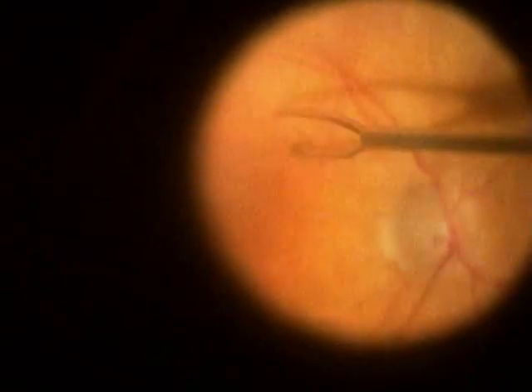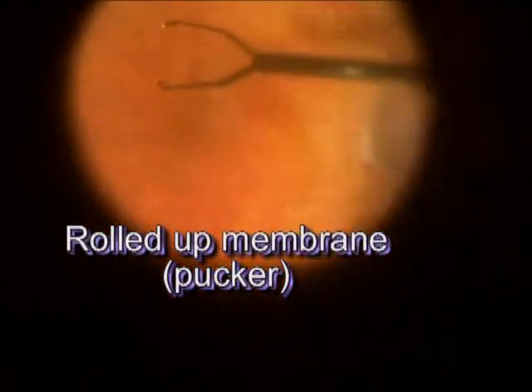Here you see the edge of the macular pucker more clearly. This pucker came off in two pieces. Most of the action is on the left-hand side of the screen — the pucker is being elevated and gently peeled away.